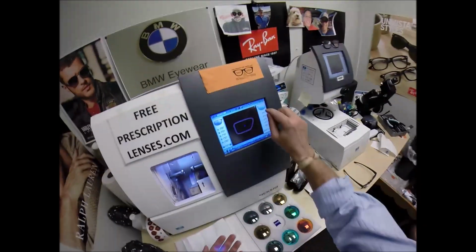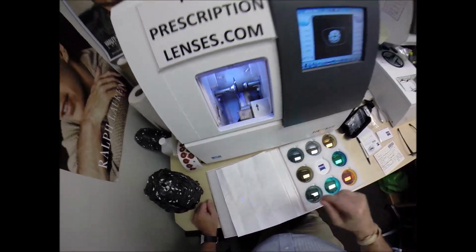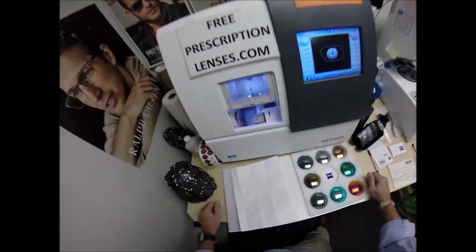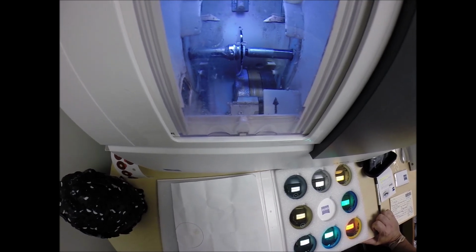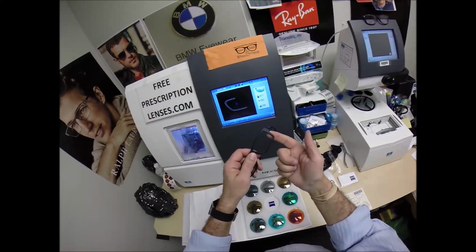So, let's go ahead and put the left lens in, flip that over to L, place the magnet into the chuck, the Charles, the Chucky baby, or today I'm calling it the Jim. Hit the green button, the door closes, the clamp shuts, the lens is going to be traced again by the 2 white styluses, making sure that it's large enough to fit into the frame. First go around, and you can see it's tracing the shape of the left lens.